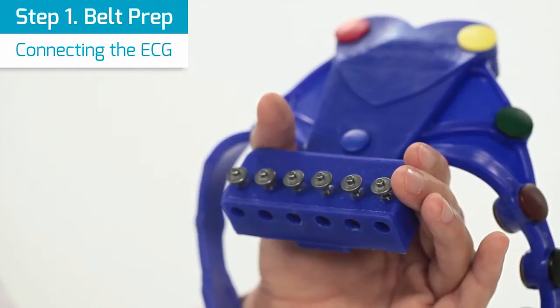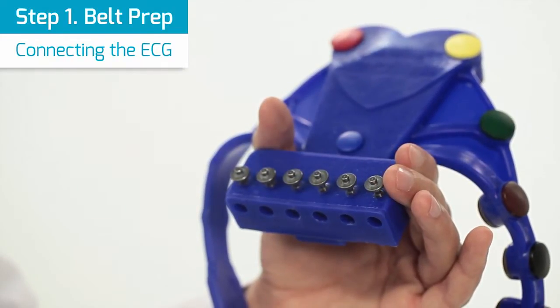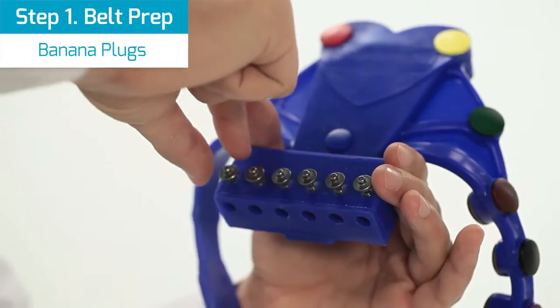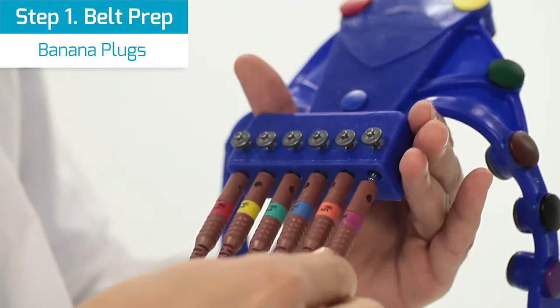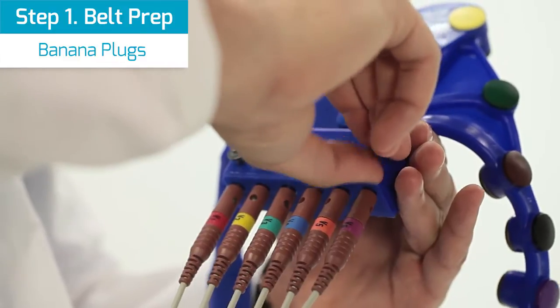First, connect the ECG patient cable to the LevMed belt. Note that there are three connection options depending on the ECG patient cable plugs. Option 1: banana plugs. Open the screws, insert the banana plugs, and tighten the screws to ensure no movement.